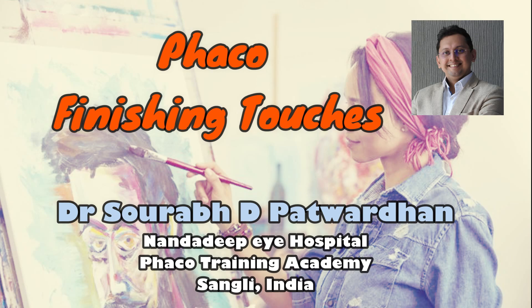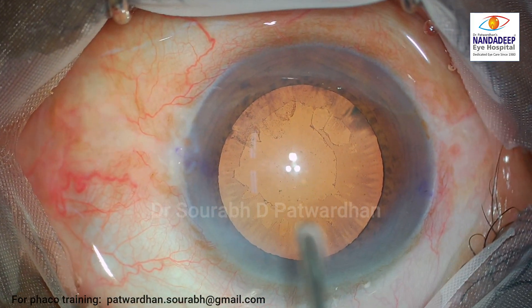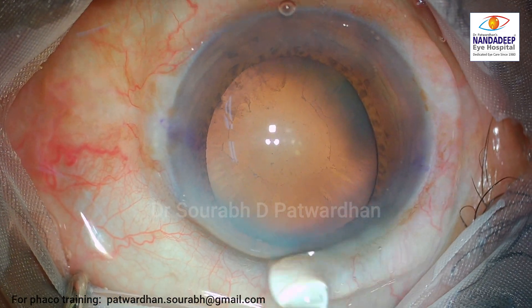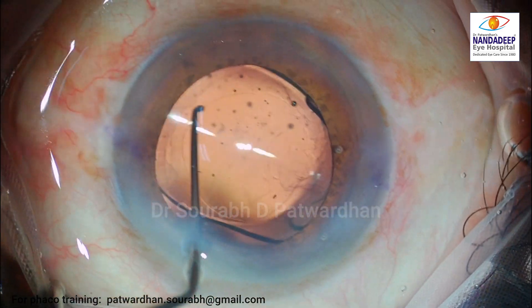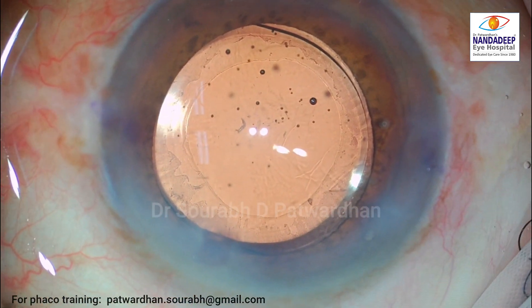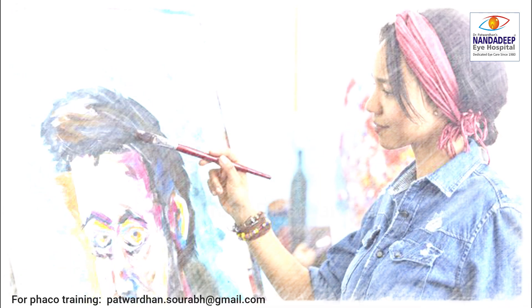Let's have a look at this case. The patient has pseudo exfoliation, a mild one, and all is set for a good FACO emulsification surgery. We'll shift directly to the near end of the surgery where I have completed FACO emulsification and placed the IOL in the bag — looks nice and fine. But surgery is an art, and just like artists need some finishing touches at the end, we can also add something to give more value to our surgery.